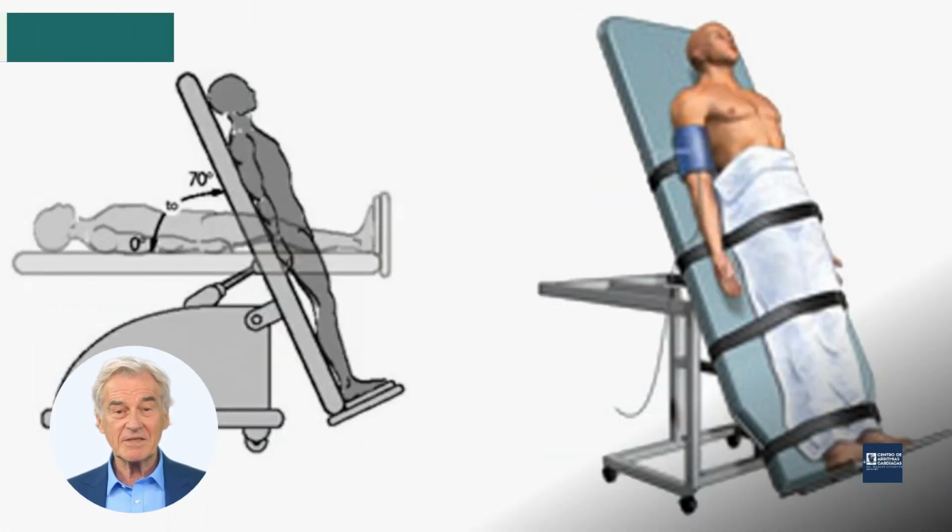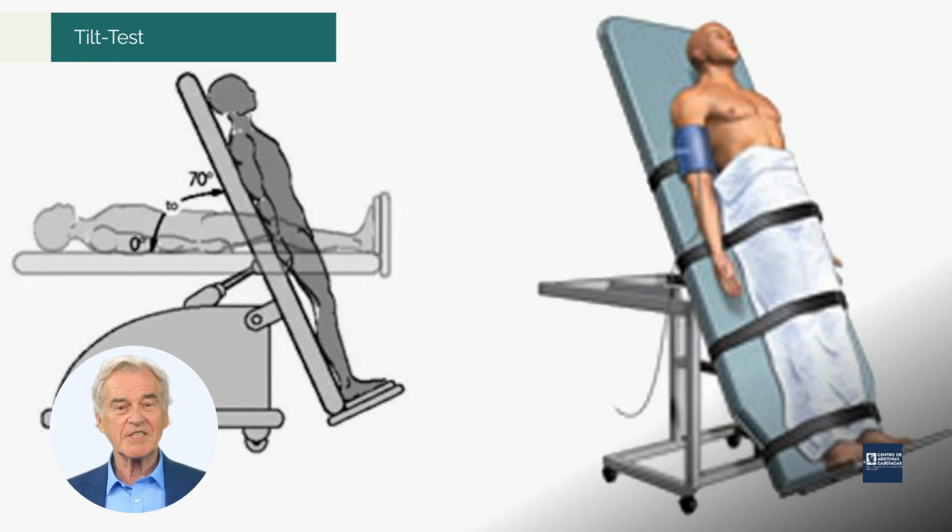During the test, the patient will remain in an inclined position for approximately 40 minutes. Should it be necessary, the physician may administer specific medications to accelerate the heart rate, simulating the effects of physical exercise. Throughout this period, the physician will routinely inquire about the patient's well-being and ask if any symptoms such as dizziness or palpitations have emerged.